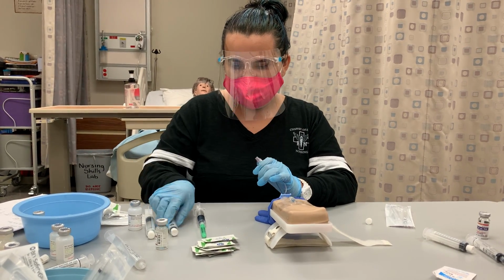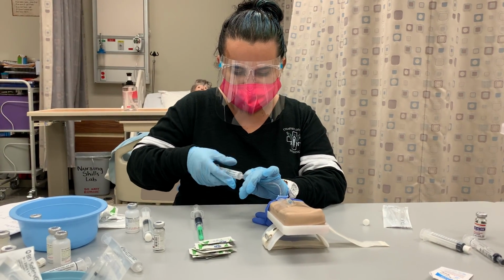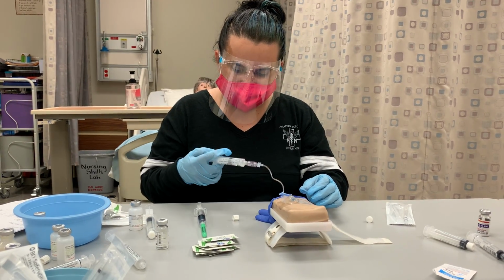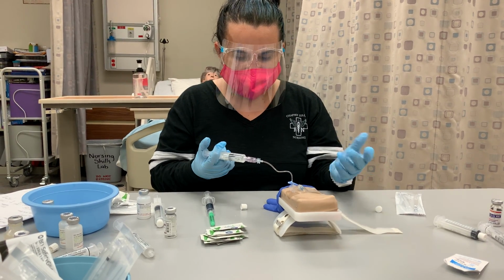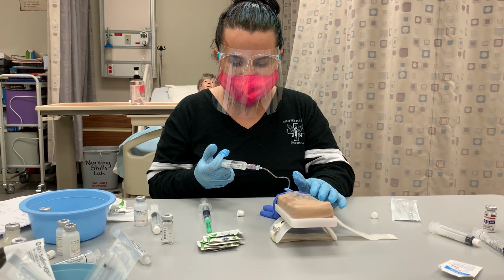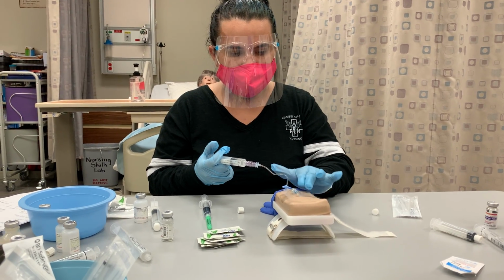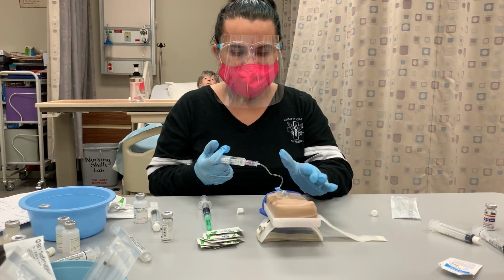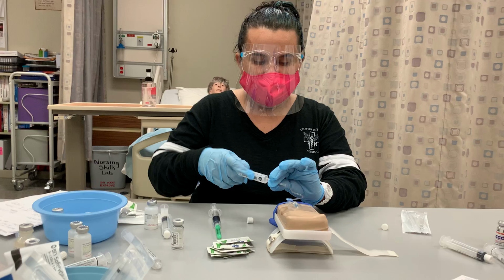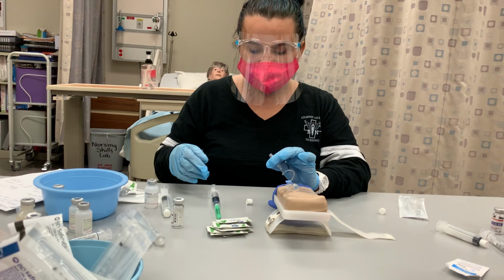And from here, I want to grab my other saline flush, and I'm going to attach. I am going to be administering 3 mLs of normal saline, just to make sure that the IV site is patent. So while I'm doing this, you know, Mr. Smith, how are you feeling? Do you feel any pain while I flush? Okay, no, there's no pain, there's no infiltration, redness, inflammation. So 3 mLs have been inserted. I can go ahead and unattach the saline and discard of it appropriately.